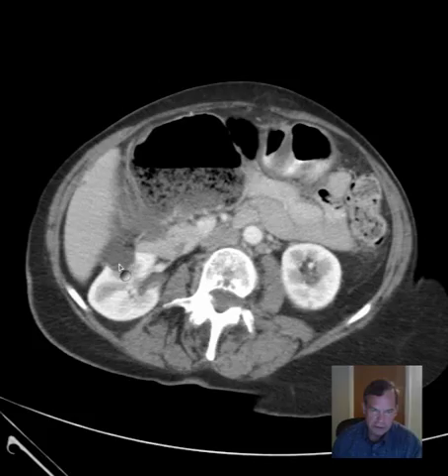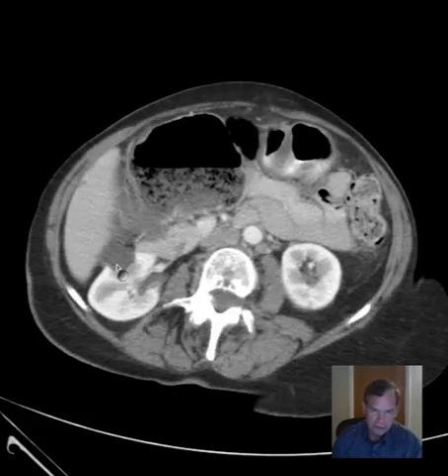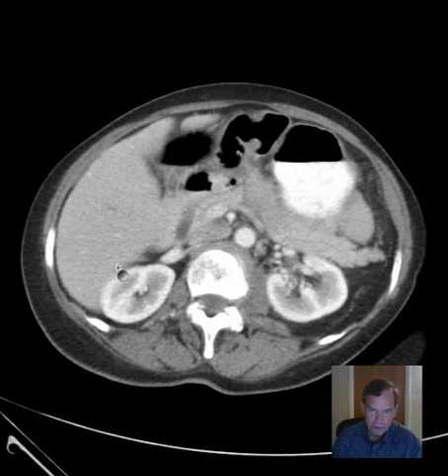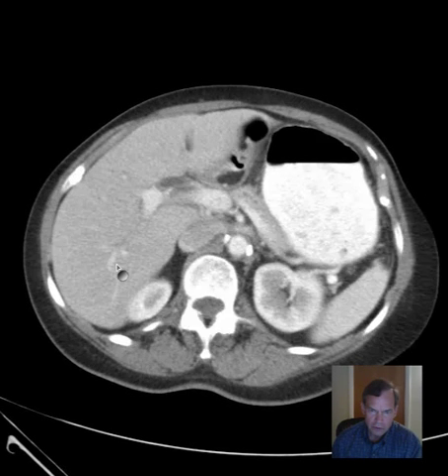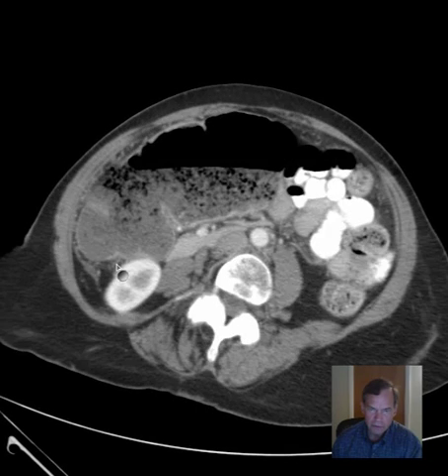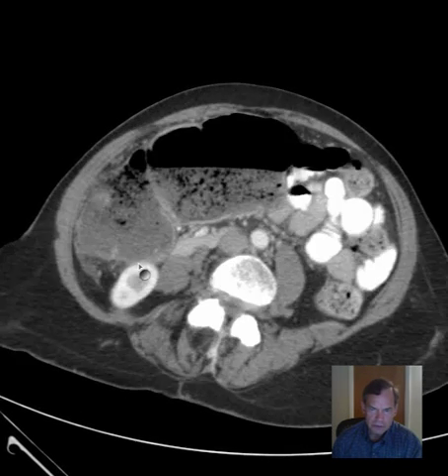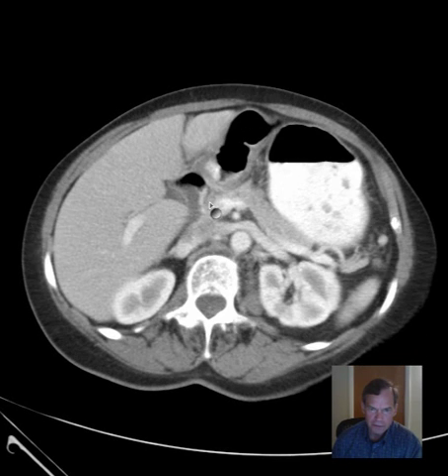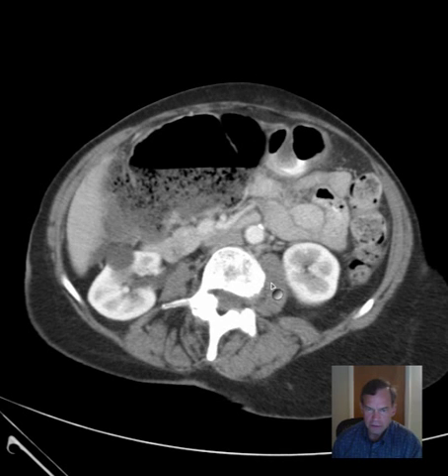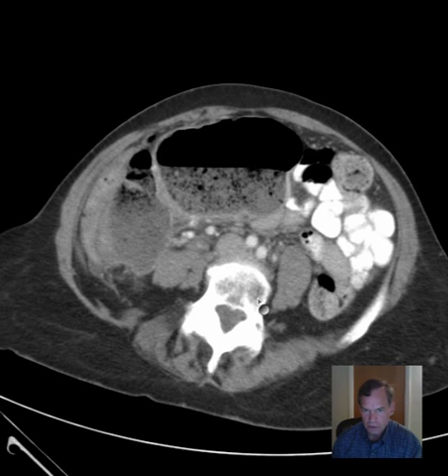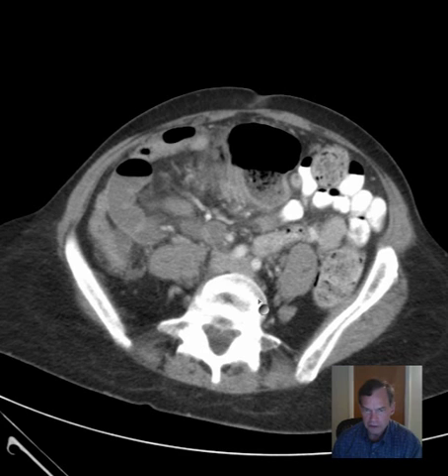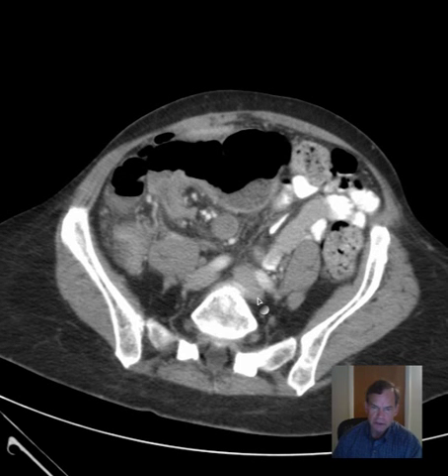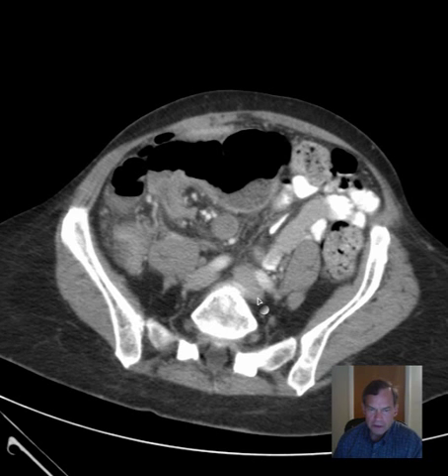We see a cyst of the right kidney, measuring what looks like about two and a half centimeters — we would measure that, of course. Kidneys otherwise appear unremarkable as we course down through from the top to the bottom here. You can see the lumbar spine tends to turn off to the left, which is an indication of some degree of scoliosis.